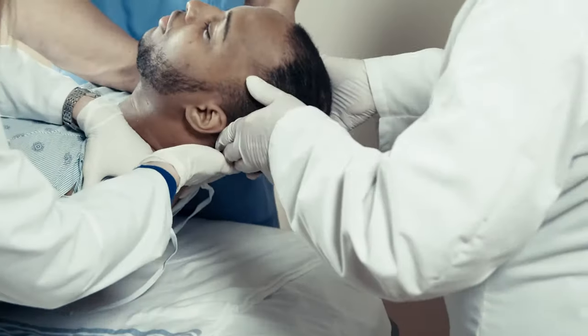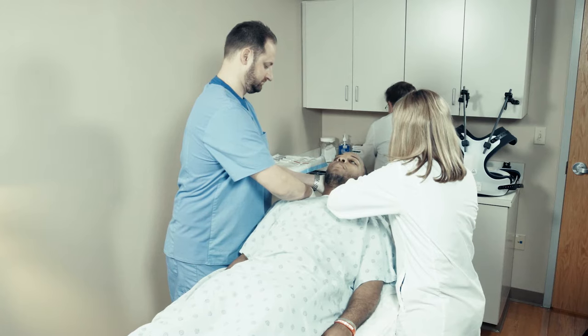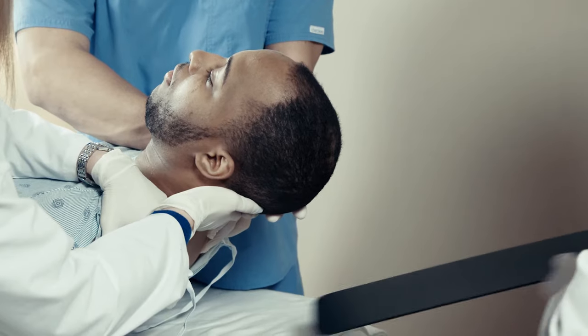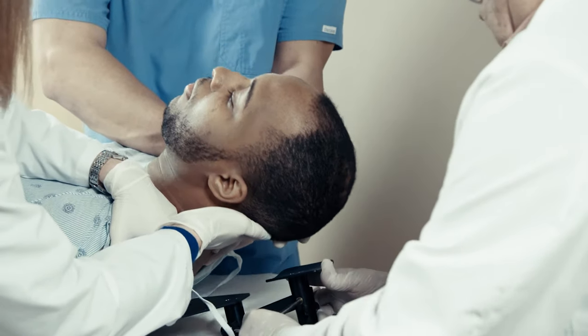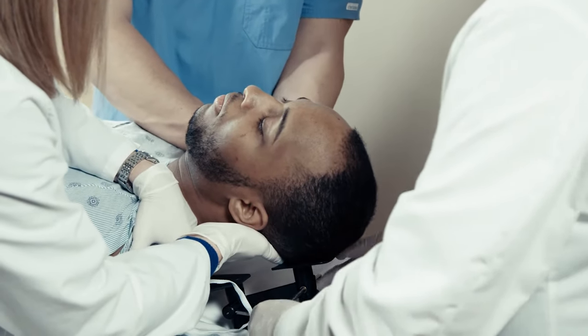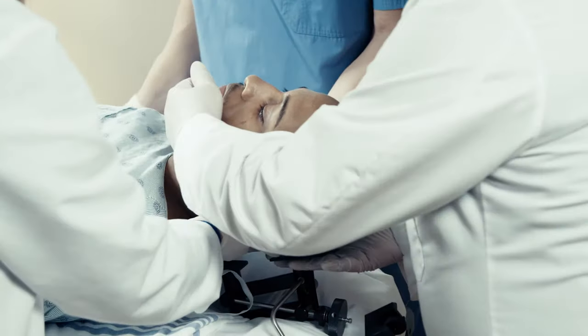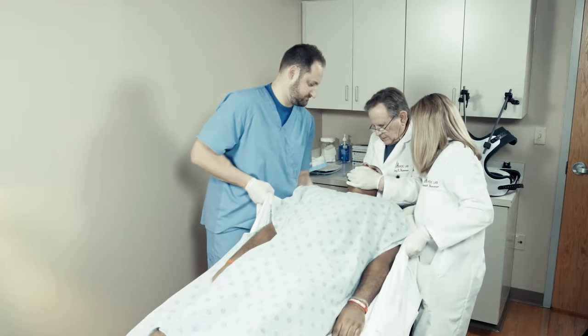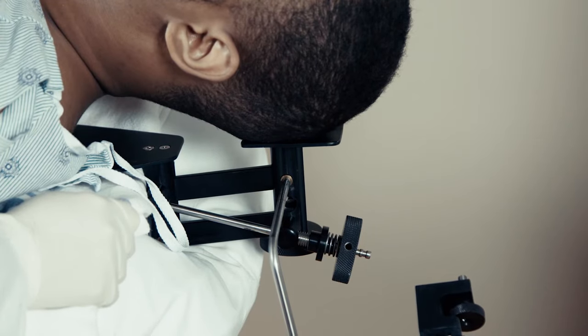Next, stabilizing the head and shoulders and keeping the patient's hips firmly planted, raise the patient's torso slightly. Place the positioning board or skate assembly underneath the patient. Make sure that the spoon is locked in place. Then gently lower the patient onto the positioning board with the head resting in the spoon. The patient's head will be just above the head of the bed.